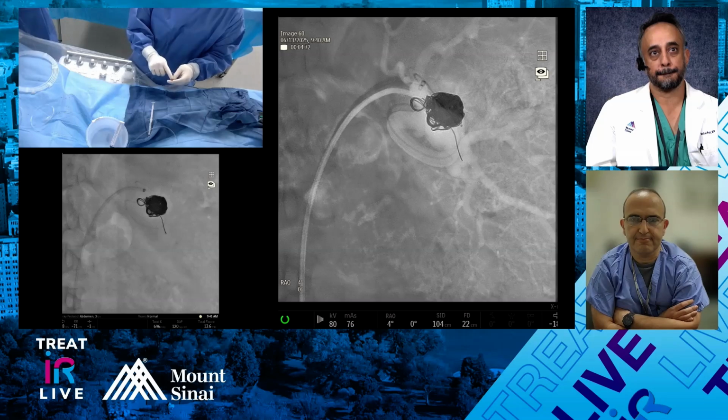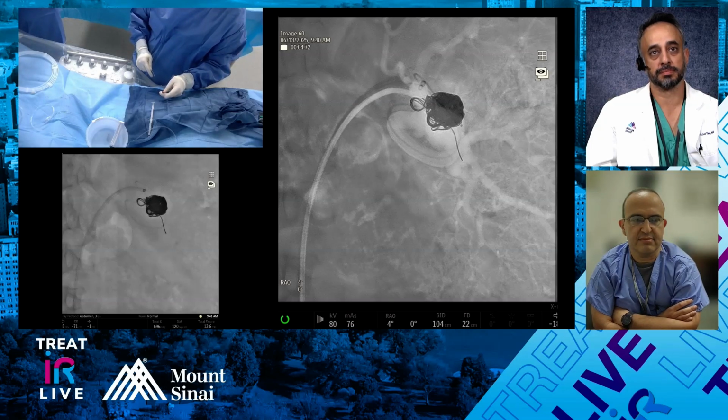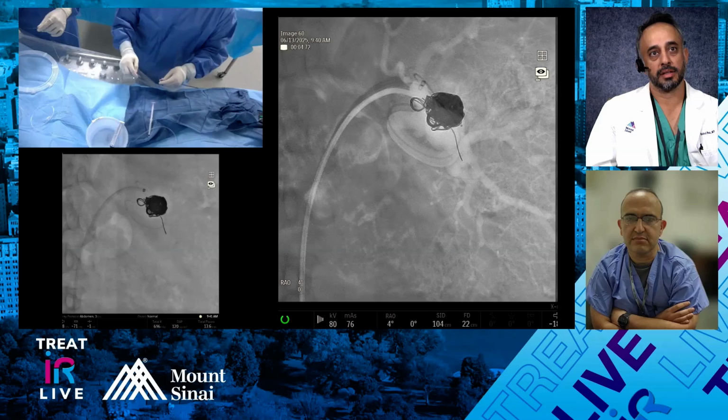This is also, by the way, a very good sign. Before, we wouldn't have any backflow of blood. Now we do. So to me, that's a very good sign that we're towards the end.